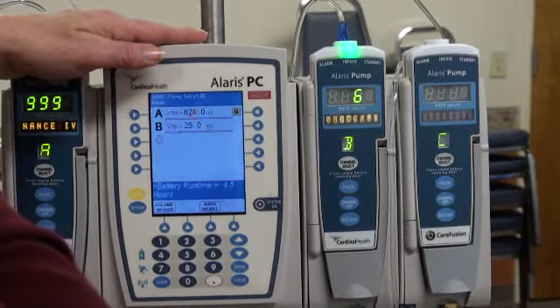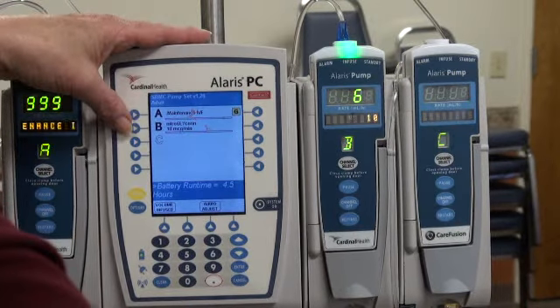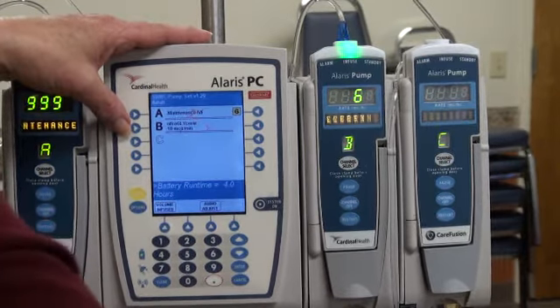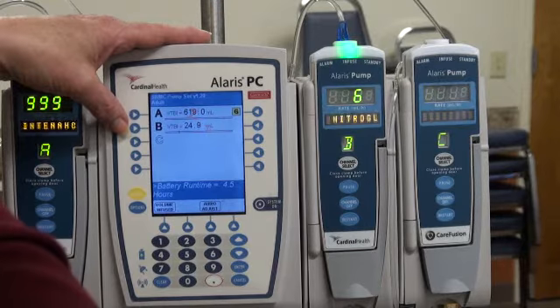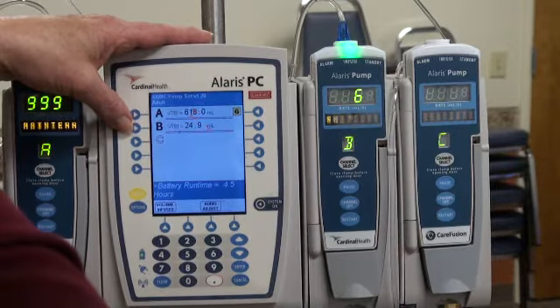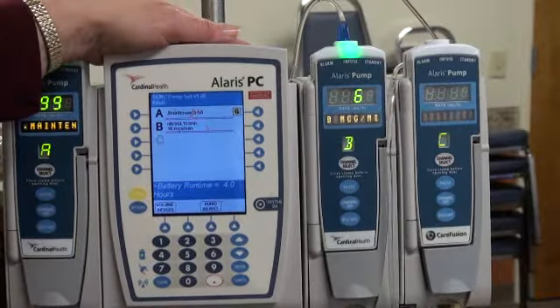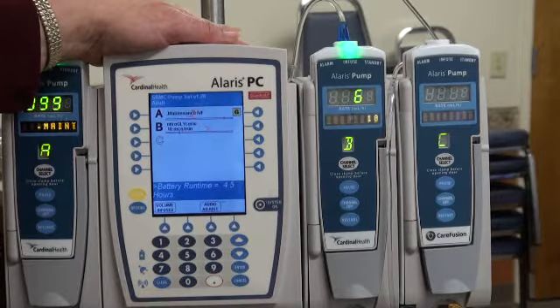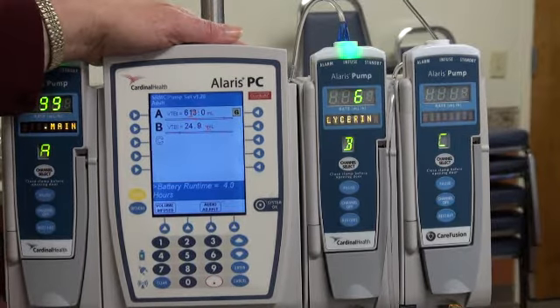When you deliver your patient to the hospital, just make sure you tell them that the volume infusion was completed on your nitro, and you also titrated up on your nitro because your patient got increased pain. Tell them it's now at 10 mics a minute, and you set your volume to 25 mil. Anytime you change anything on your IV settings on the way to the hospital, make sure you tell the receiving hospital what you did so they can check. You can tell them you had a doctor's order to titrate the nitro as needed for the pain.